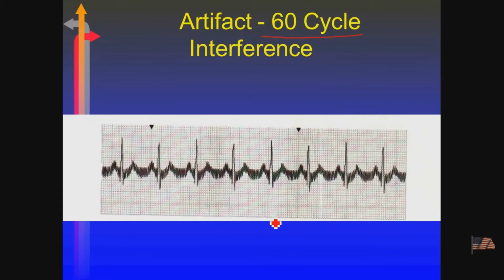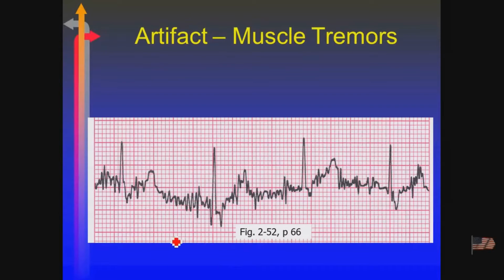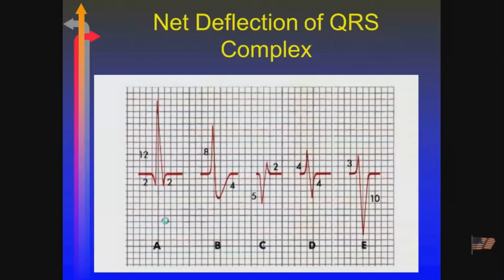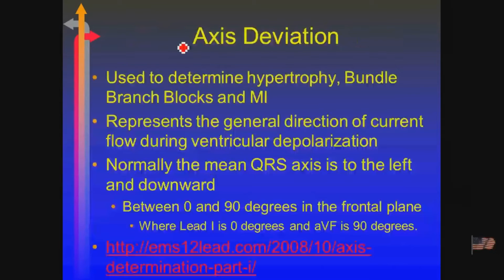But there you go. This is an artifact caused by either loose wires or a patient moving a lot. Remember my dad was in the CCU and he was sitting there going like this with his electrode, driving the nurses nuts. Showing off like that. Muscle tremors or seizures, you can end up getting where you can't make out the baseline. So you want to be able to identify the different types of artifacts that are present and how we would go about correcting them. All right.